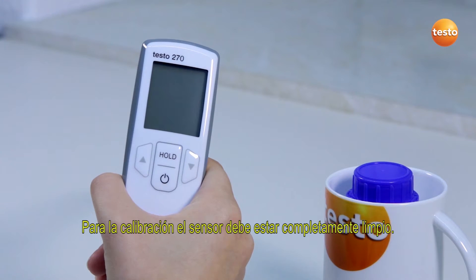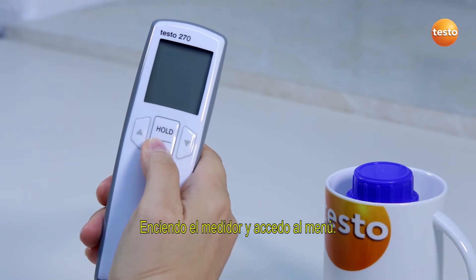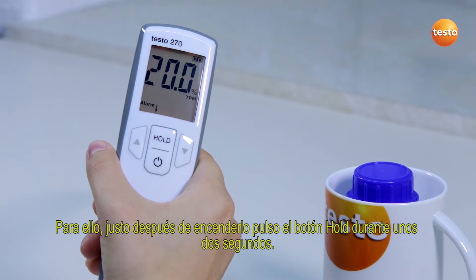For the calibration, the sensor must be completely clean. I switch on the tester and call up the menu. To do this, I press the hold button for about 2 seconds immediately after switching on.